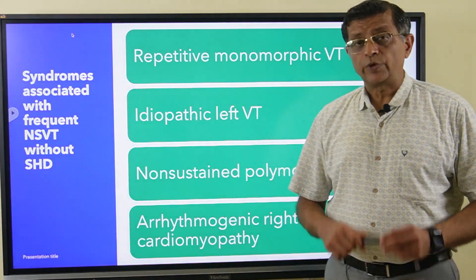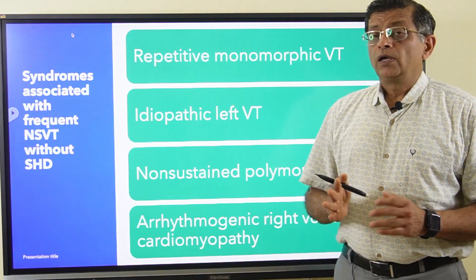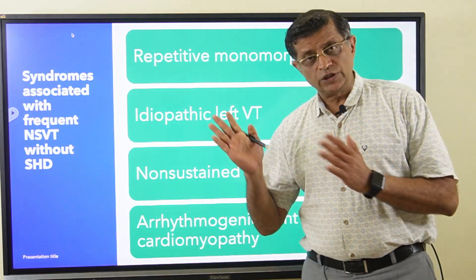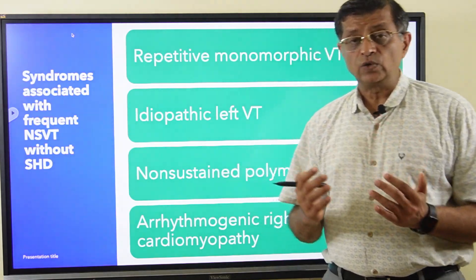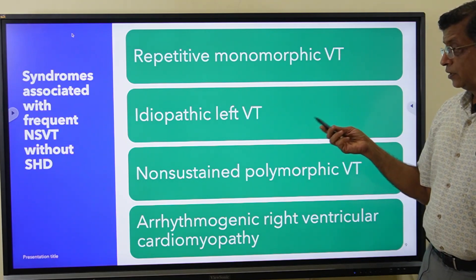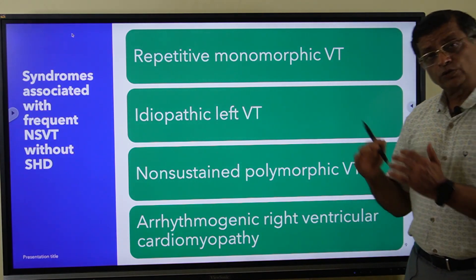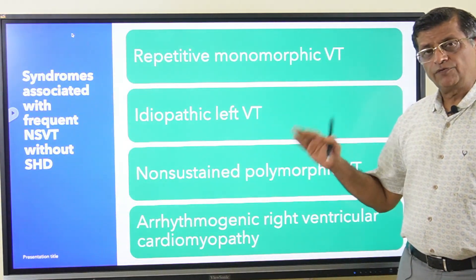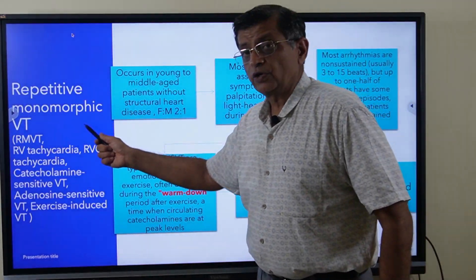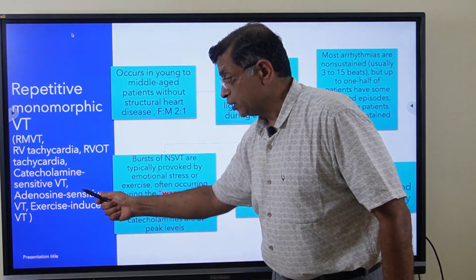Once we confirm the wide complex tachycardia is indeed ventricular tachycardia and not SVT or atrial fibrillation with aberration, there are four different syndromes associated with NSVT. First is repetitive monomorphic ventricular tachycardia; second, idiopathic left ventricular tachycardia; third, non-sustained polymorphic ventricular tachycardia; and fourth, arrhythmogenic right ventricular cardiomyopathy.